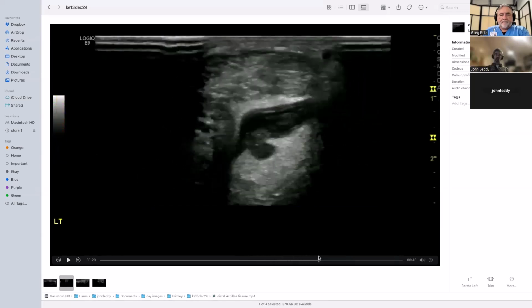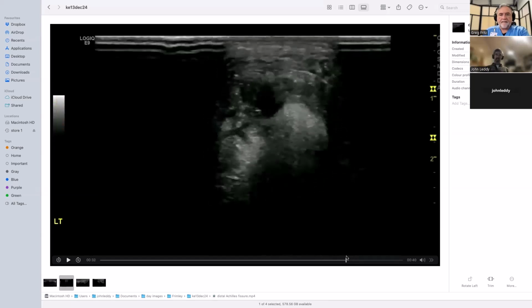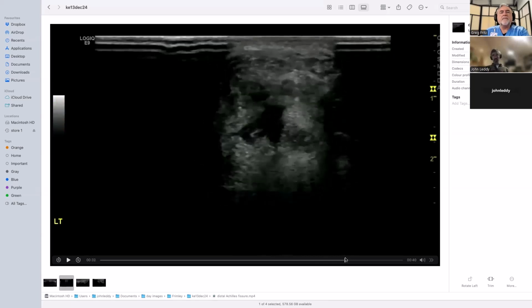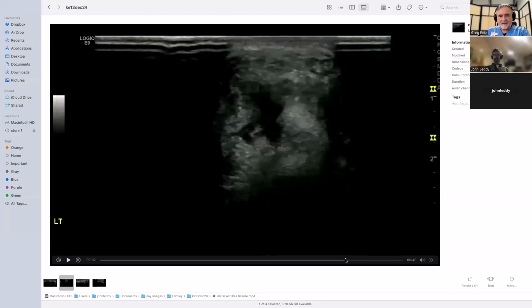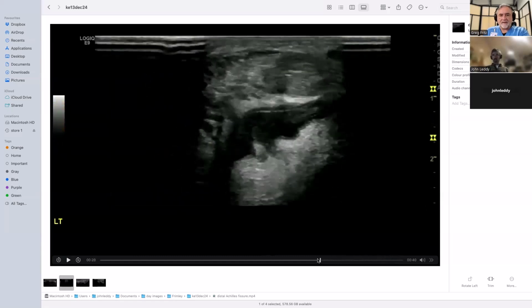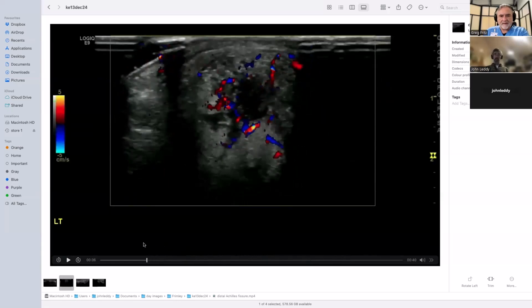But on balance, I would say I think this is a fissure within the tendon. I don't think that would necessarily change management, but it would make me much less happy about someone trying to, because people will sometimes try and convince me, sometimes successfully, to put some steroid in if I see an abnormal bursa. But where I see that the tendon is structurally compromised at the same point, that makes me much more reserved about whether I'm prepared to do anything to this tendon or to the bursa.